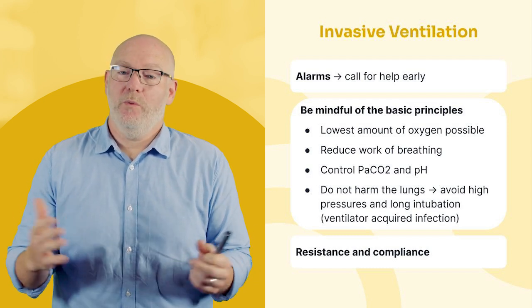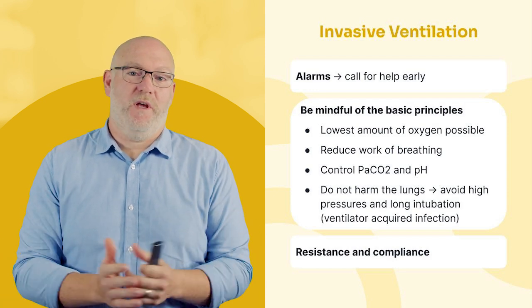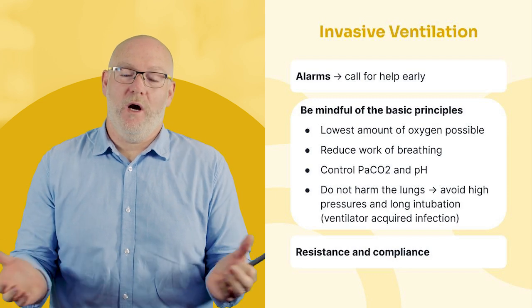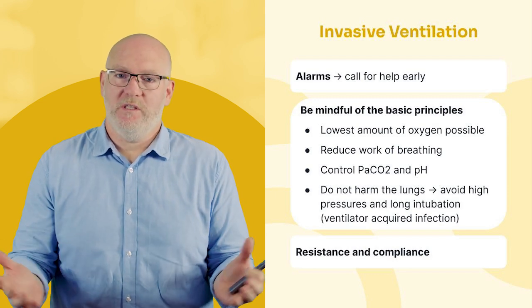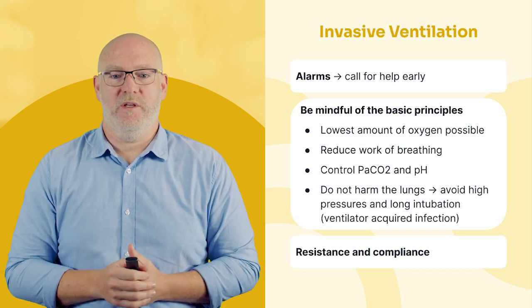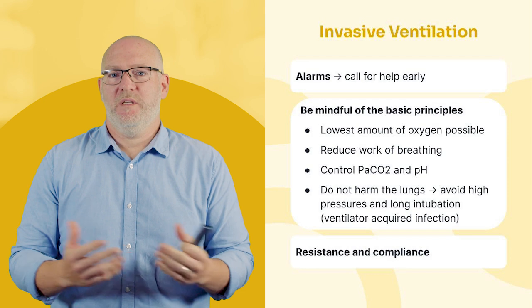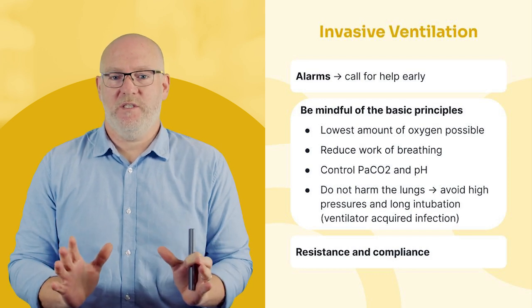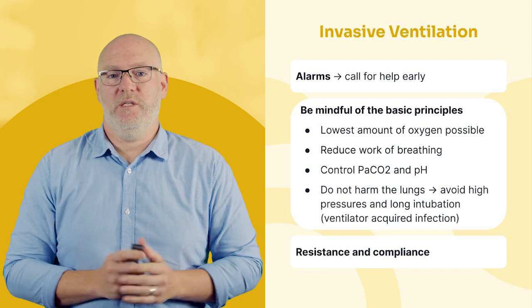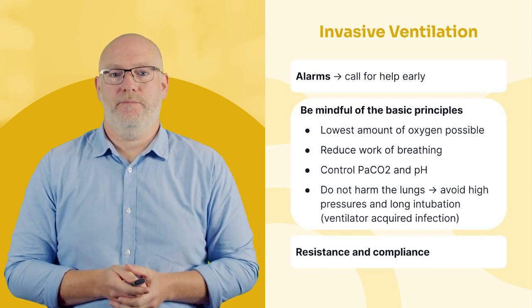Okay. The longer we leave people intubated on a ventilator, the more at risk they are of developing infections. And there is a really, really well-known phenomenon called ventilator-acquired infections. The longer you're on a ventilator, the more risk you have, basically, of developing a chest infection because of being on a ventilator. There are other really key terms like resistance and compliance, but for the purposes of basic ventilation, we won't go into that because what we've covered today so far should really set you up pretty well to look after a person on a ventilator in the first instance.